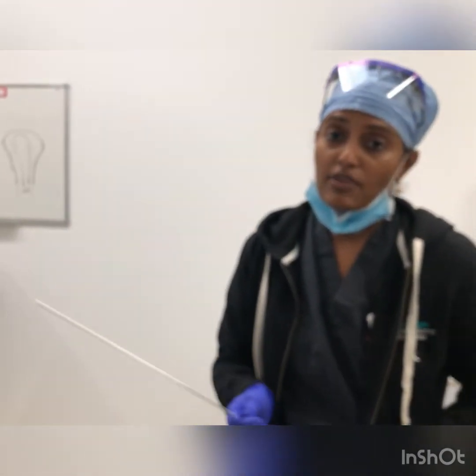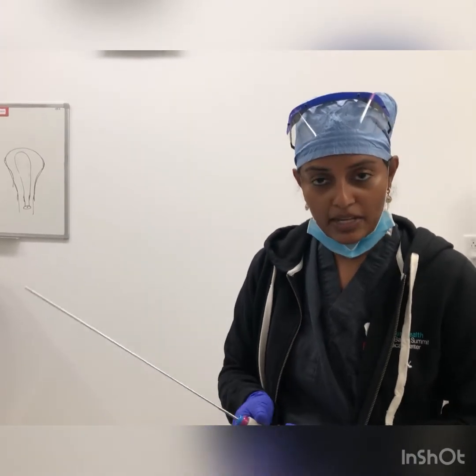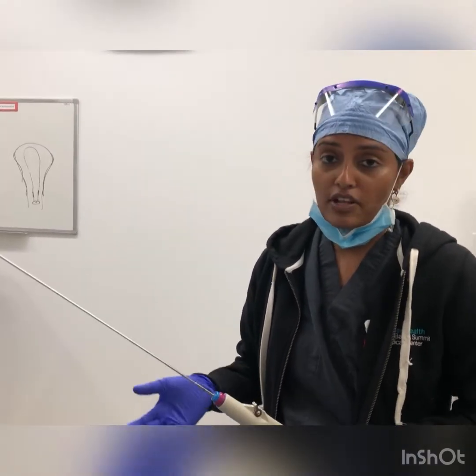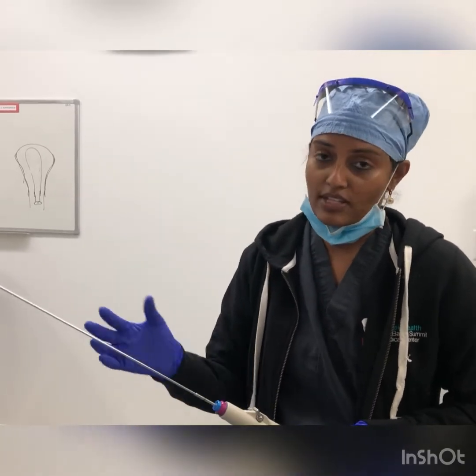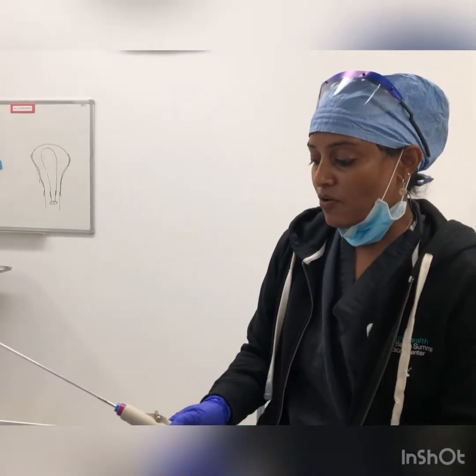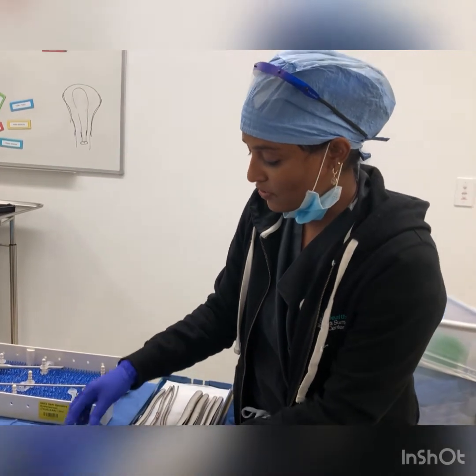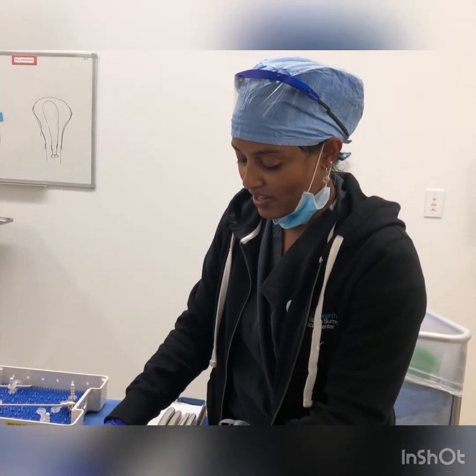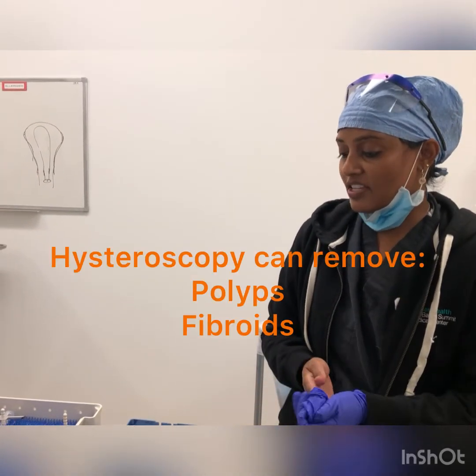Sometimes I put this in and then I realize it's actually a really tough fibroid, and then I take this blade off and put in another blade. So it offers a lot of flexibility, and there's also a suction system that sucks out all the chips of the fibroid or polyp that we remove. Today I actually did 5 of these cases back to back, and they all went well. In some patients I had polyps, in some patients I had fibroids, but this is what a hysteroscopy is all about.